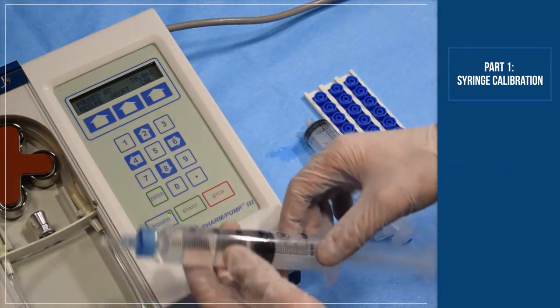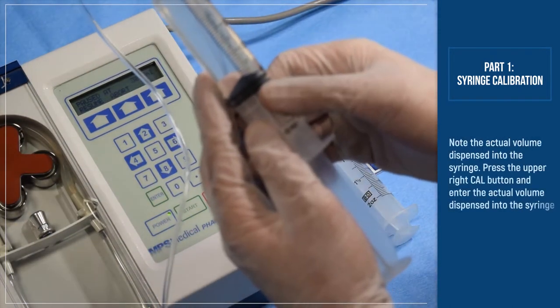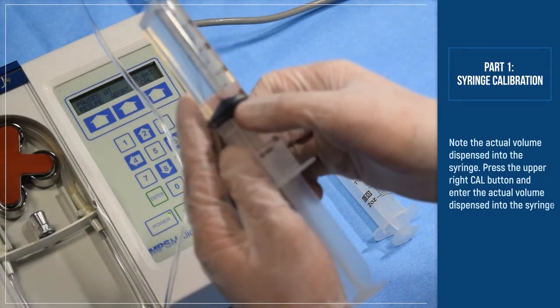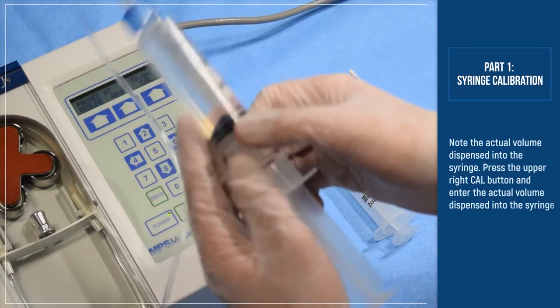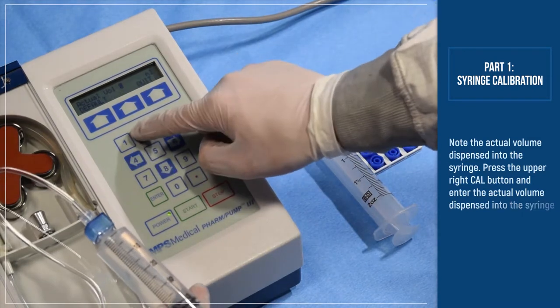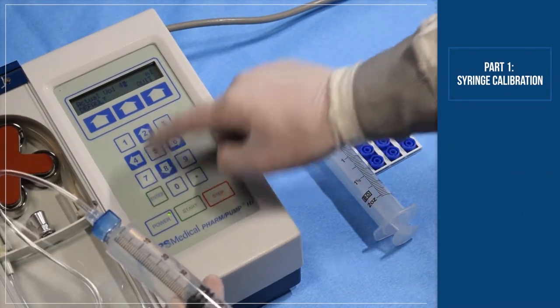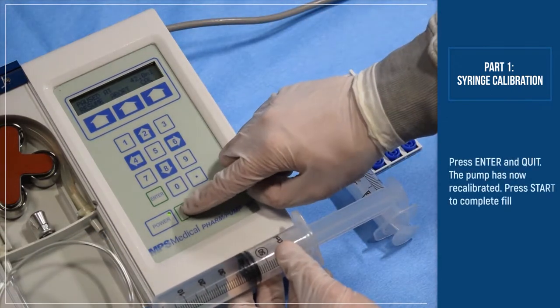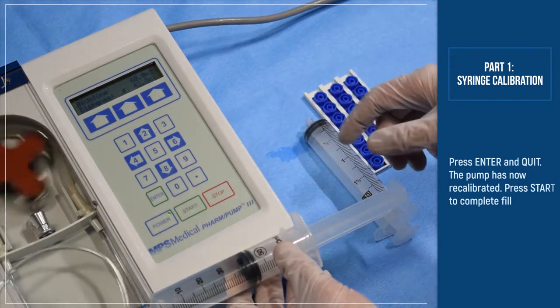Press stop. Note the actual volume dispensed into the syringe. Press the upper right hand corner Cal button and enter the volume. Cal. Actual volume dispensed. Enter. Quit. The pump is now recalibrated. Press start to resume the fill.